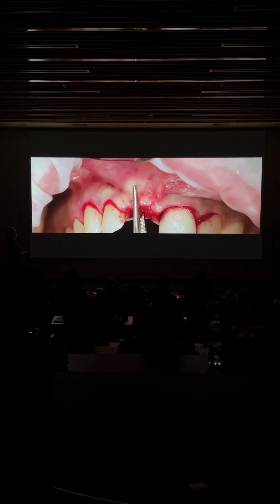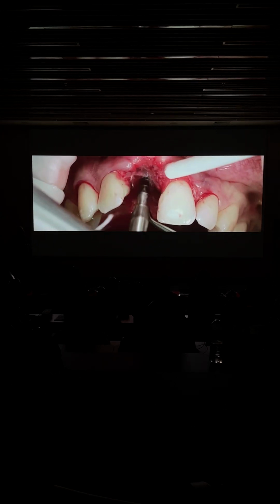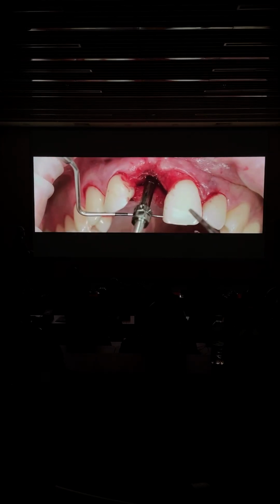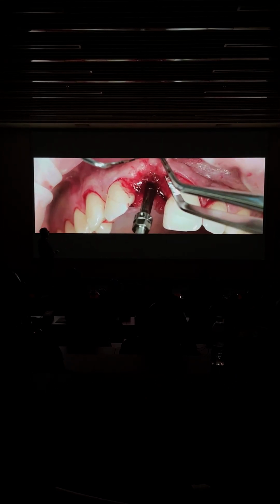I don't do vertical releasing incision, only when I do GBR, and usually I do only one releasing incision, not two. The more you do releasing incisions, the more you are decreasing the blood supply, the more you are creating scars. It depends how you do it. So this partial thickness flap, my connective tissue gets blood supply from the periosteum. This is freehand. At that time, all cases, you can see the mobility of the flap.